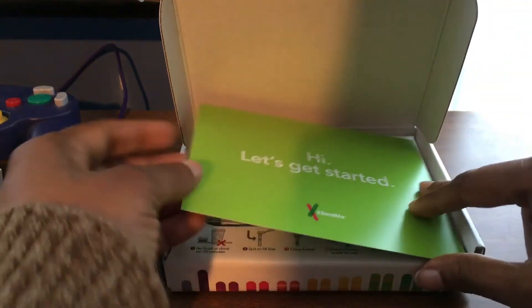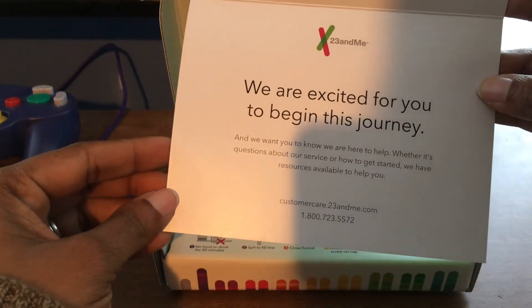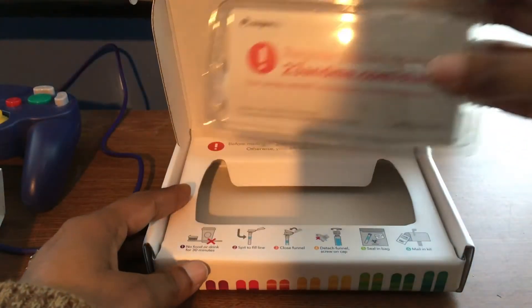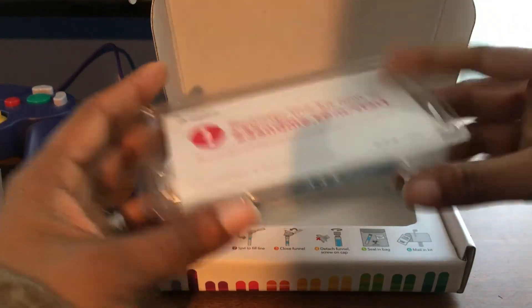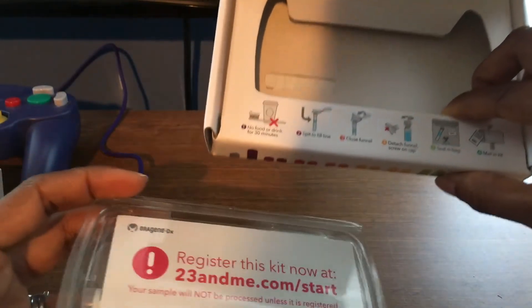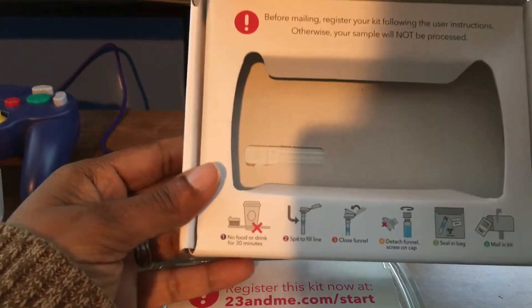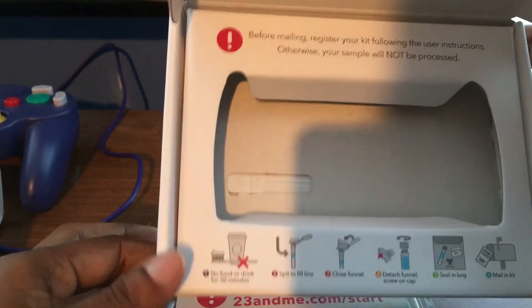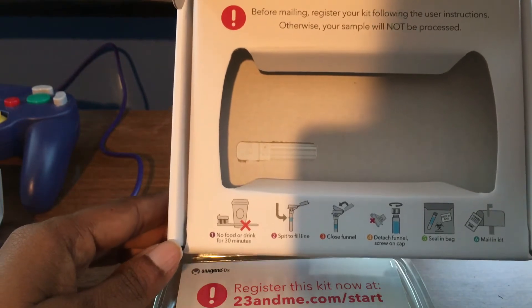Okay, so here we get a little card that says hi, let's get started. And then there's this little kit here. The instructions say before mailing you need to register your kit, otherwise your sample will not be processed.